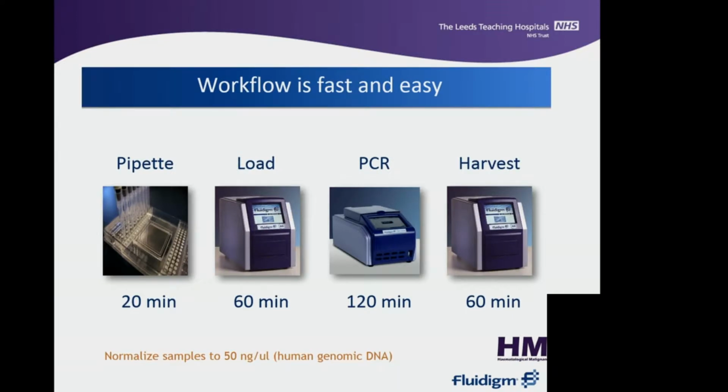The workflow is really simple, really hands-off. Again, the amount of hands-on time from library preparation to actually setting up the sequencing is about 2.5 hours. Again, there's no robotics involved. We use multi-channel pipettes to load our arrays. We load it onto a controller unit, and this controller unit is the system that basically under pressure pushes our samples to their appropriate positions.